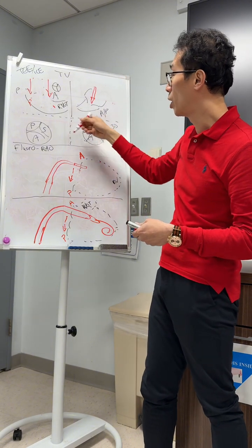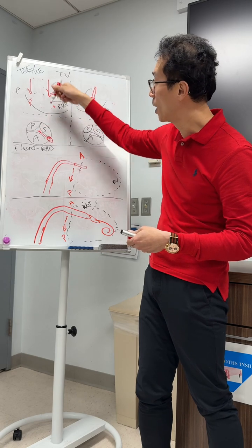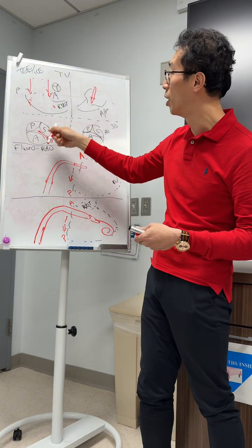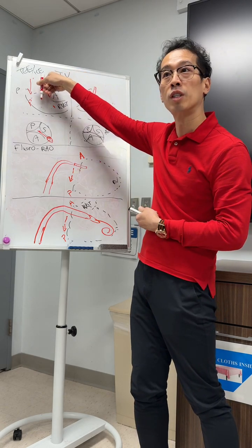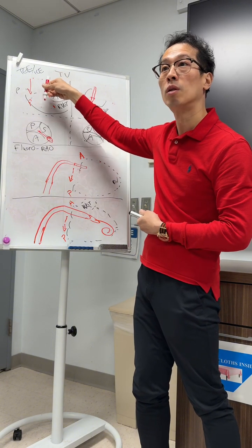And of course, with MPR and transgastric, you'll see that. This is AS commissure. This is more PS, so same thing. If this shifts this way, this shifts this way. Same thing with TTVR. If your device is here, I'm too anterior. I need to remove some clicks to move it central. And then you do the same thing, and you should see it on MPR.